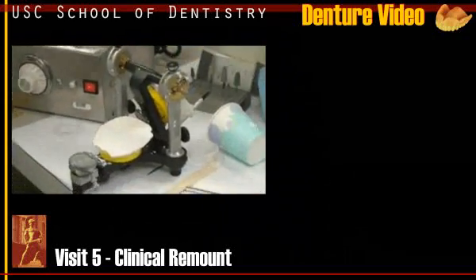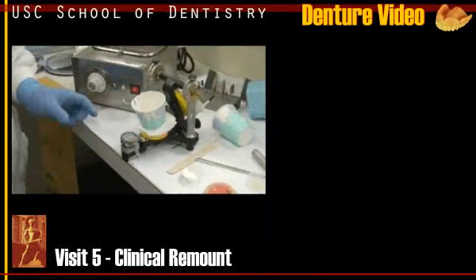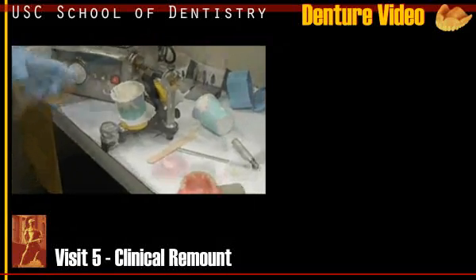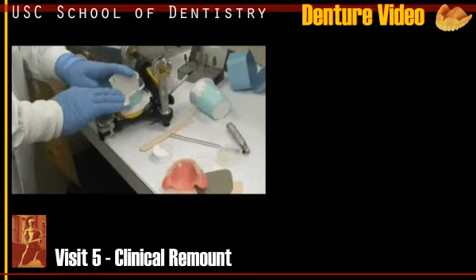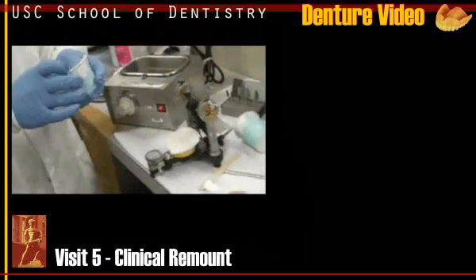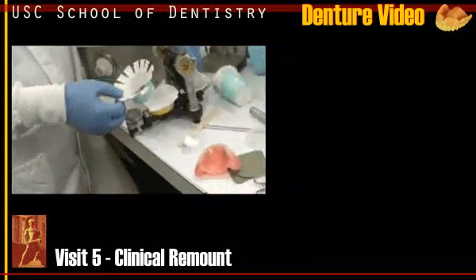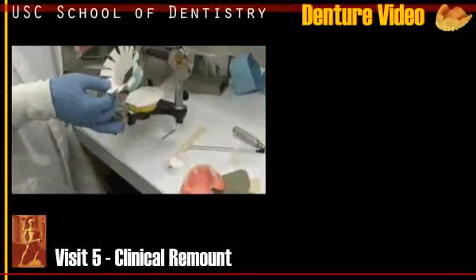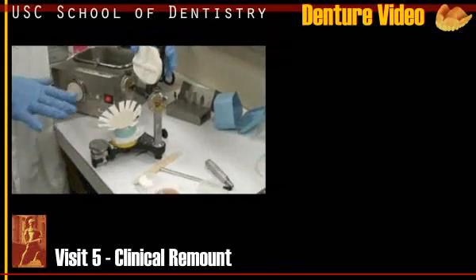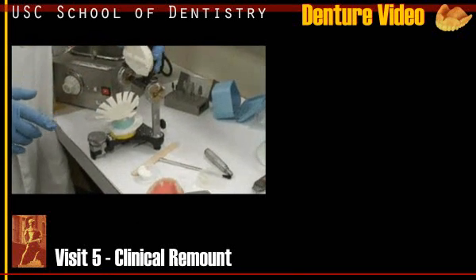So does this eliminate the need of the face bow then? That's right. So you put it in here, and this is already engaged with the plaster, right? You bend it in here like this, like an open flower. That's a nice little thing. This is not in the manual. It'll be in the newer one then. And then you apply the plaster onto this area, right?